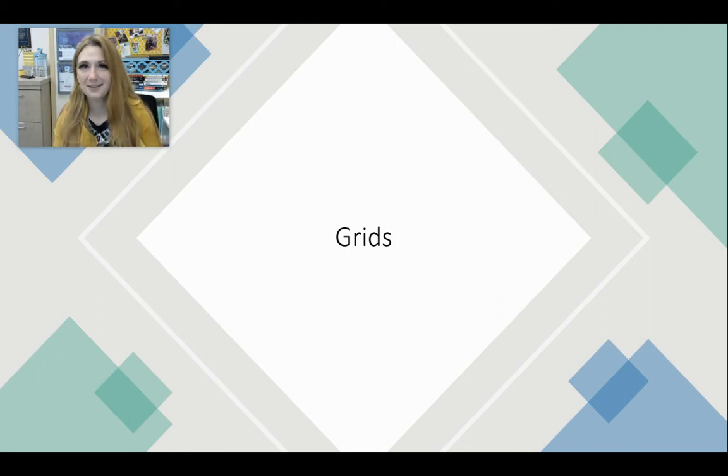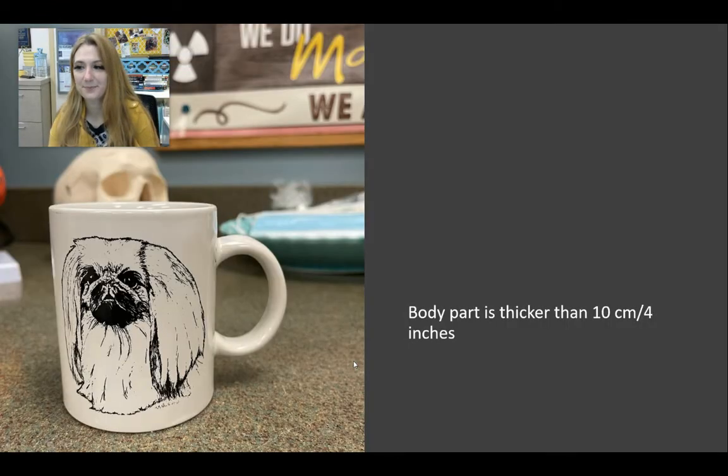Let's talk about grids. Whether you are a student who's going to need to take a registry, a new graduate who's figuring things out at your new job, or you've been in the field for years but you're about to sit for your CQR exam, it's important to know about grids, both practically and for examinations and registries. So let's talk about them.